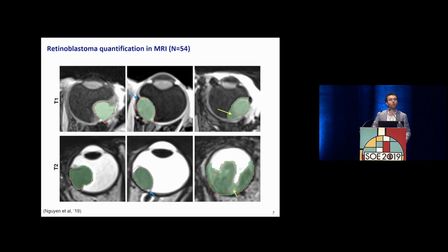And then you can start playing with this idea. So here are some results on a fairly small study for retinoblastoma patients, using T1 and T2 MRIs to delineate these tumors. And in some cases, it does quite well. It allows you to bring out some decent results, and sometimes it's just off, okay? In red are the tumors demarked by hand, and in green are the predictions of the method.